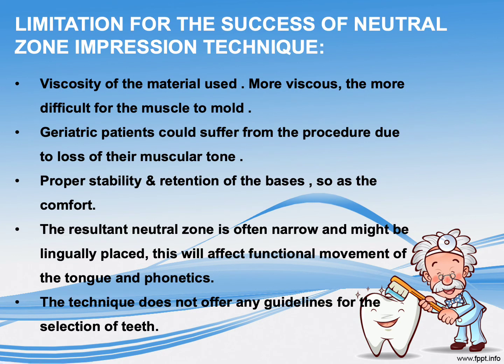Limitation for the success of neutral zone impression technique: Viscosity of material used, more viscous, that means more difficult for the muscle to mold. Geriatric patients could suffer from the procedure due to loss of their muscle tone. Proper stability and retention of the bases so as the comfort.